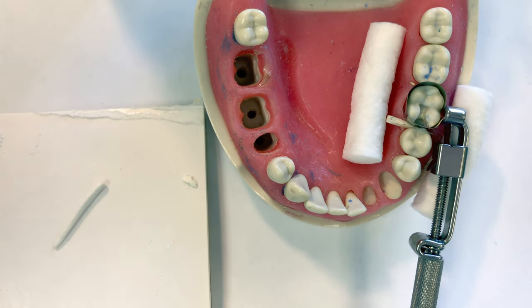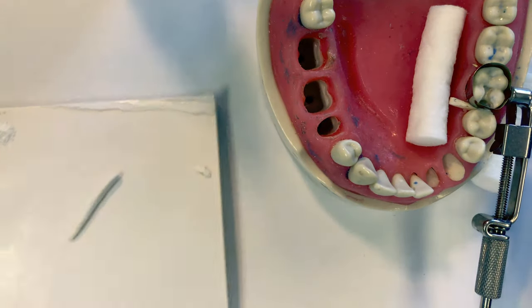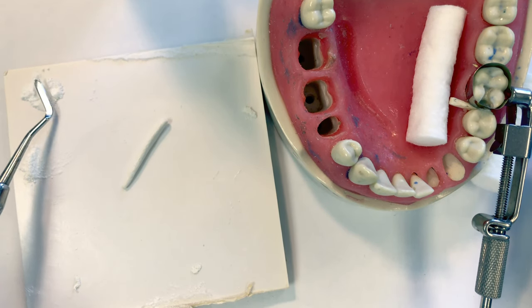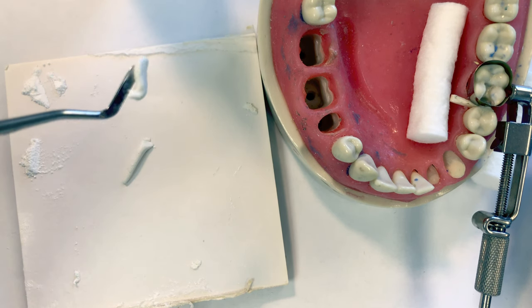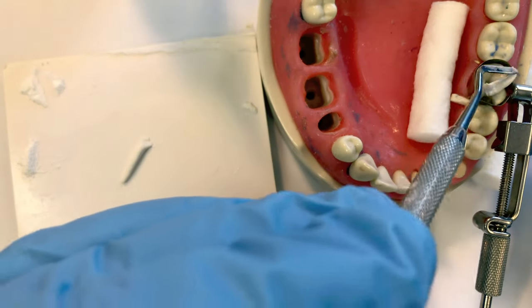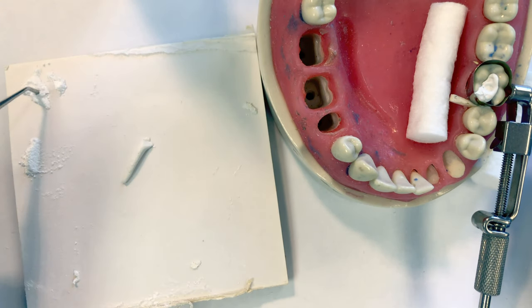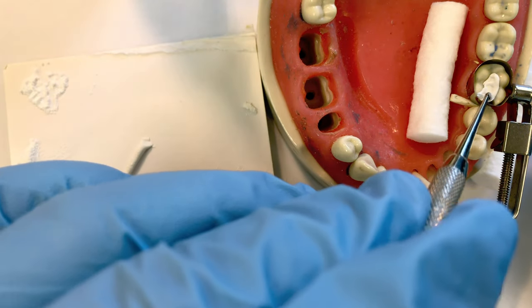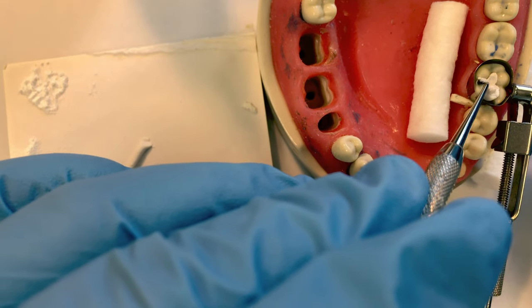I like to dip my Woodson into the extra powder — that will help prevent the material from sticking to your instrument. Pick it up with the paddle end of your Woodson and deliver it into the preparation. I'll dip the condensing end for the same purpose, to prevent it from sticking, and then I can pack the material into the prepared tooth.